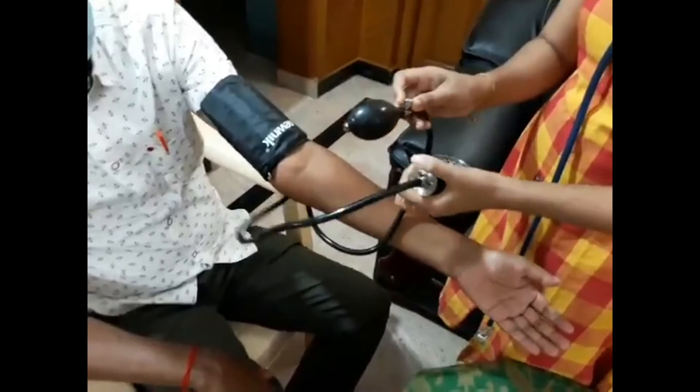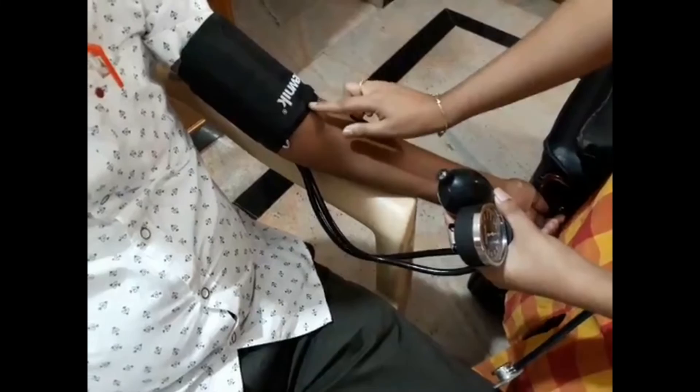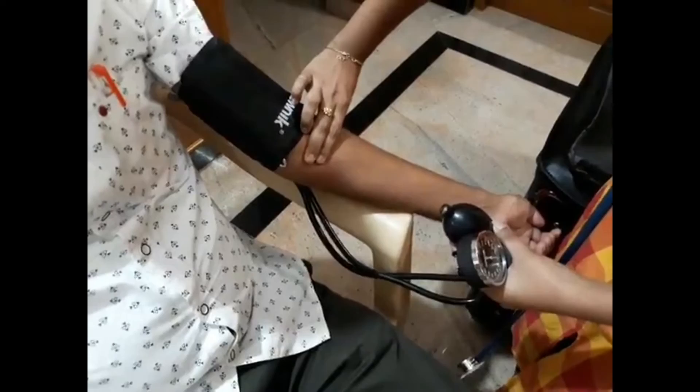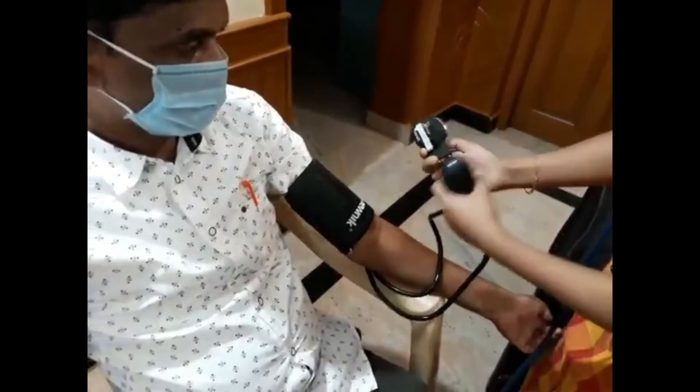This is the elbow crease. Divide it into two halves and take the median half. In this median half, divide it into two again. In that half, you can locate the brachial artery of the patient. I am placing the manometer gauge using the clip over the cuff.